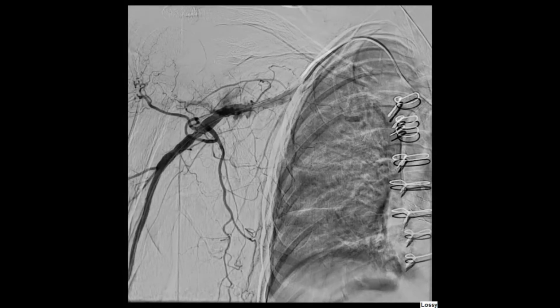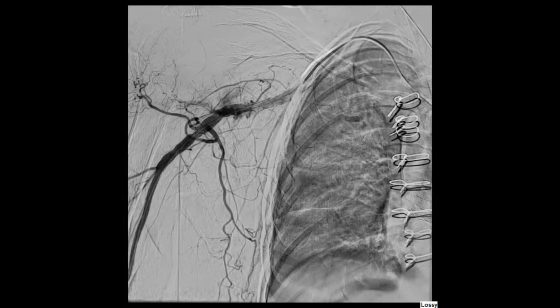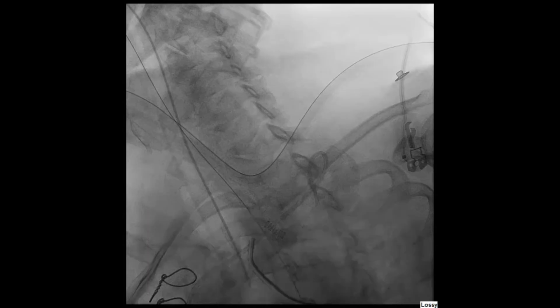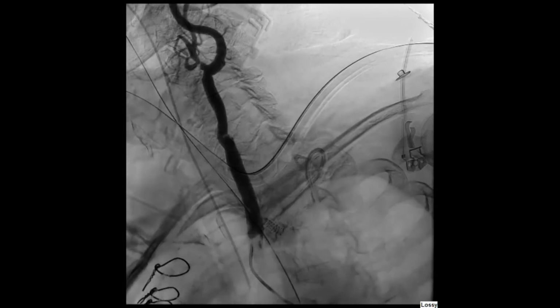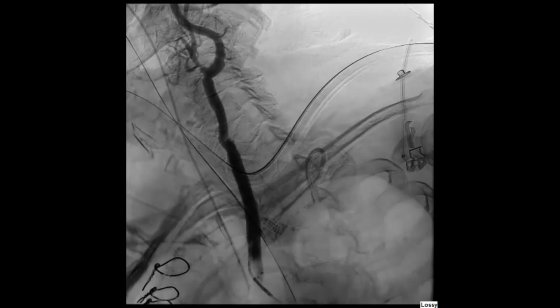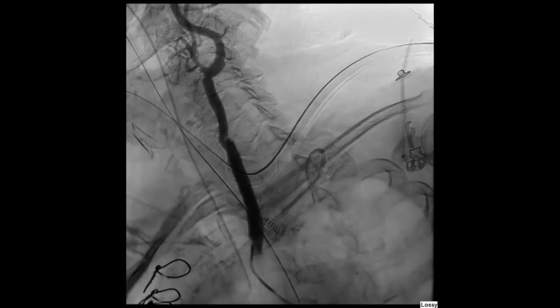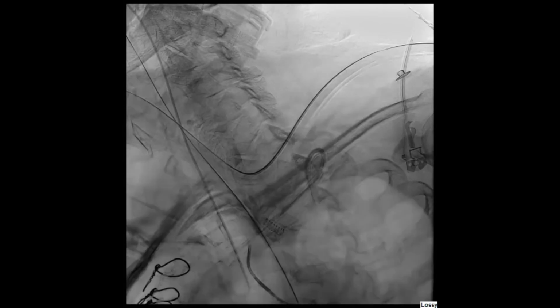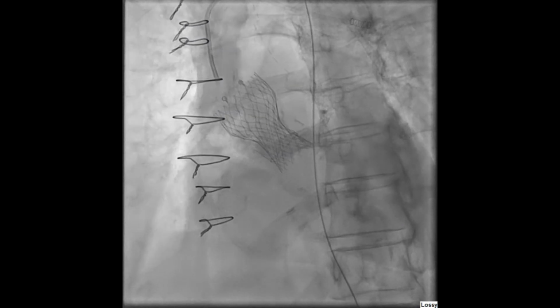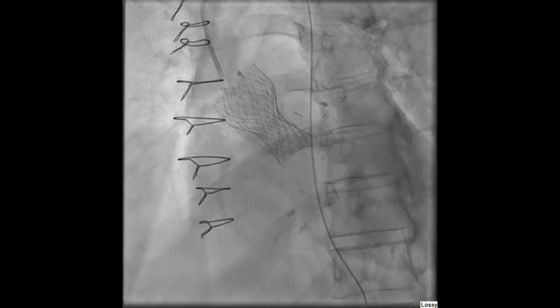The arterial ECMO cannula was removed on postoperative day 1, and manual pressure was further applied for good hemostasis. Left carotid angiography demonstrated less than 50% stenosis at the access site, with the neurointerventional radiologist recommending no further interventions and ultrasound surveillance. The valve appeared to be in stable position and completely expanded.